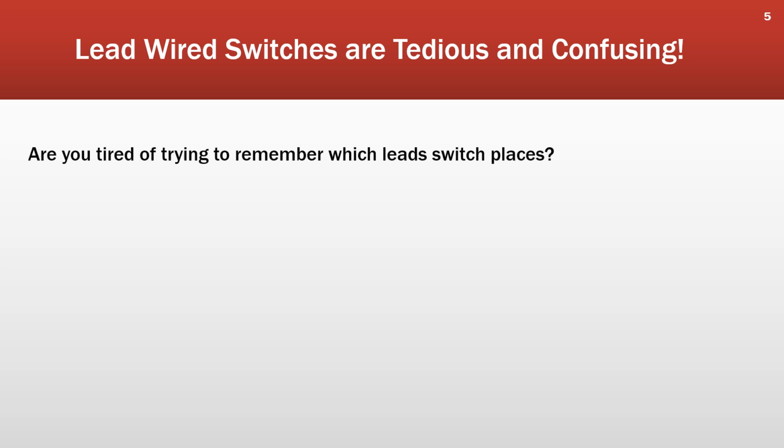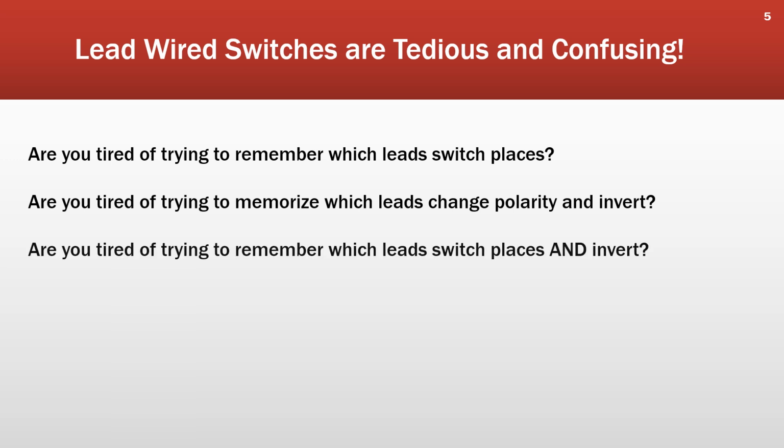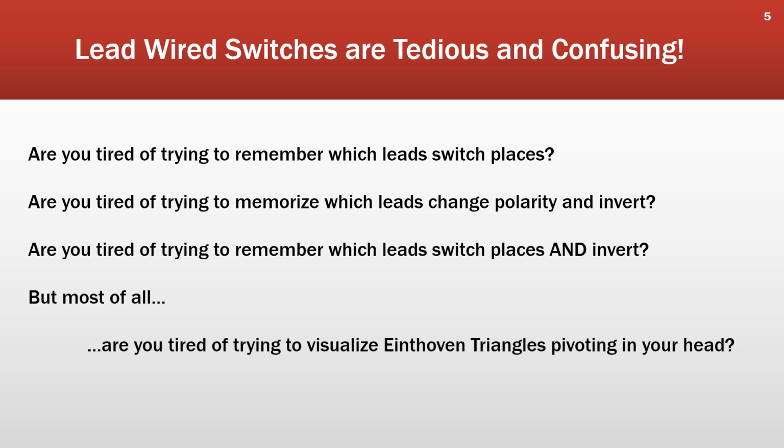Are you tired of trying to remember which leads switch places? Are you tired of trying to memorize which leads change polarity and invert? Are you tired of trying to remember which leads switch places and invert? But most of all, are you tired of trying to visualize Einthoven triangles pivoting around in your head?